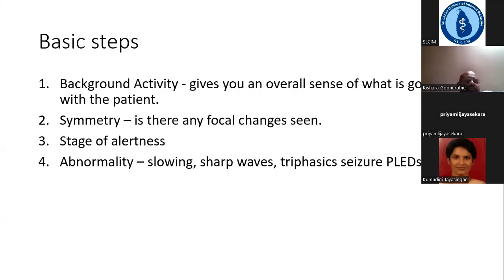Then you look at symmetry, because you should see whether there is any asymmetry between the right and the left hemisphere, right? And then also look out for how alert the patient is. For example, is the patient drowsy, sleepy, or awake? And there are changes in the EEG to suggest so.